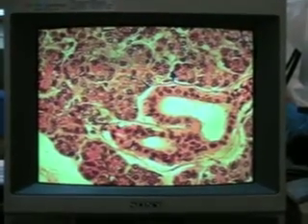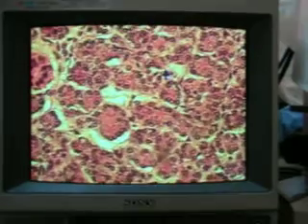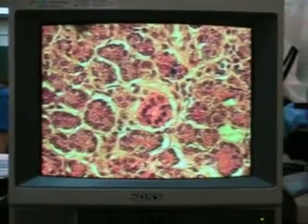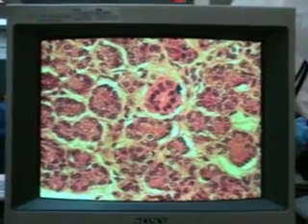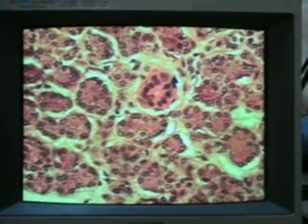And then the other duct systems are going to pretty much follow my slide. It looks a little worn out, probably like the person talking, but nonetheless, you'll see that there are parts. That's probably a striated duct that you see right there, even though it's drawn down. You can see basically the way the nuclei are located in this one. All right, so this would be an interesting striated duct right there.